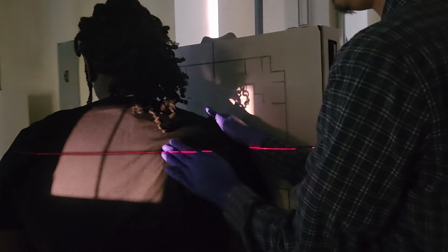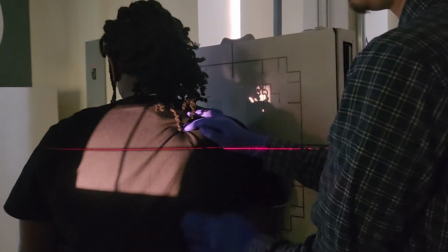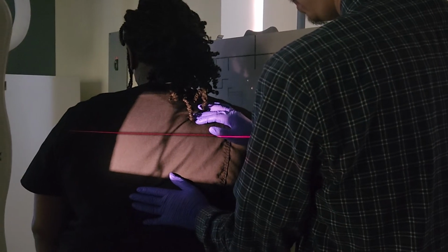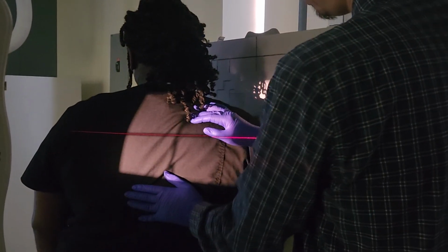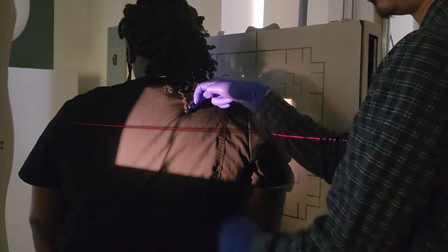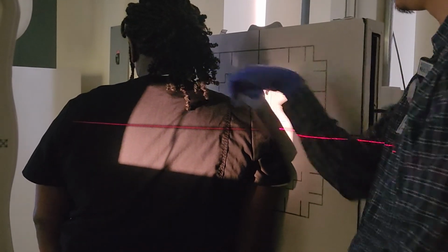All right, so we're following so far? Okay, great. So, I'm gonna hit my light. Superior angle. I'm gonna slide my patient forwards. Small step. Good. So, central ray is now right on top of my superior angle, correct?